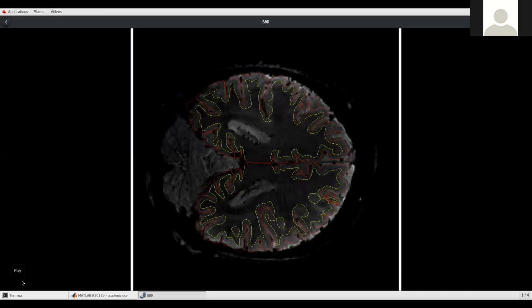John. Sorry, yeah, please. One issue is that there is no match. These surfaces are not going to match. And so it's all about managing how much error you're going to tolerate. Exactly. Is that true if we're doing non-rigid as well as rigid registration? Yeah, so the other problem is when we define the cost function, it doesn't just have to be something that we can articulate, that the registration is perfect. The cost function itself also has to be something that can be optimized. And a lot of these cost functions, you might articulate them, but they don't necessarily lend themselves to optimization.